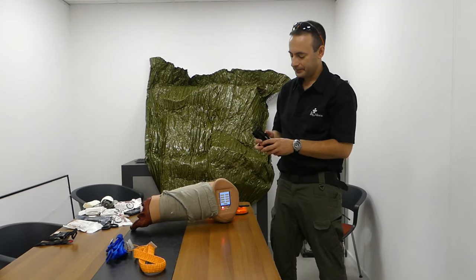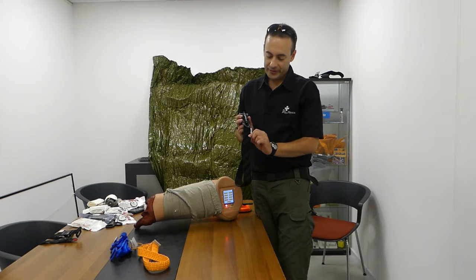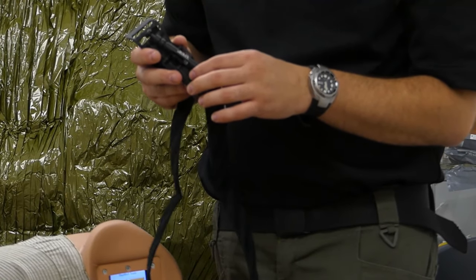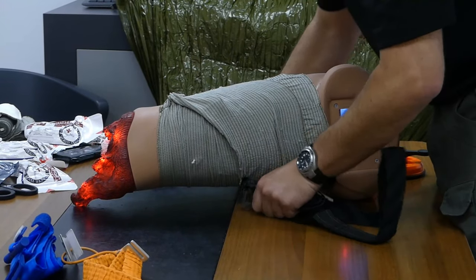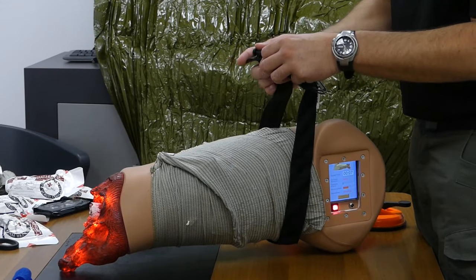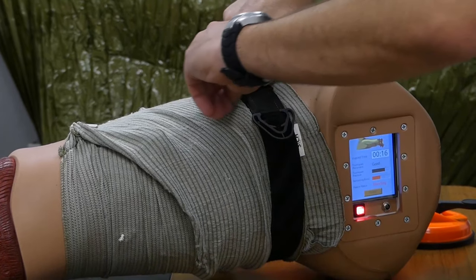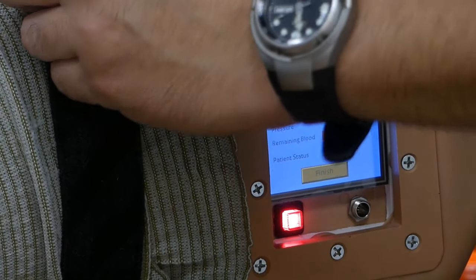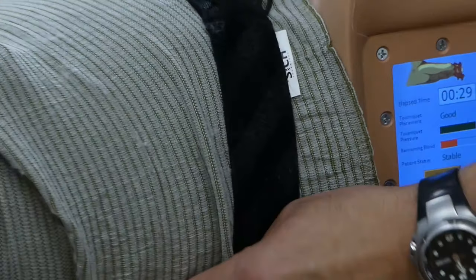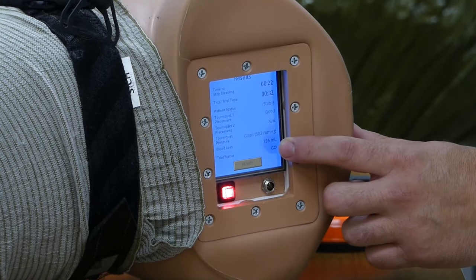That's the SICH tourniquet, made in Ukraine, based on Ukrainian battlefield experience over the last years. It features a male-female Velcro, which I've never seen before, and a metallic windlass. We got 500 millimeters of mercury with 136 milliliters of blood loss. So yeah, it works.